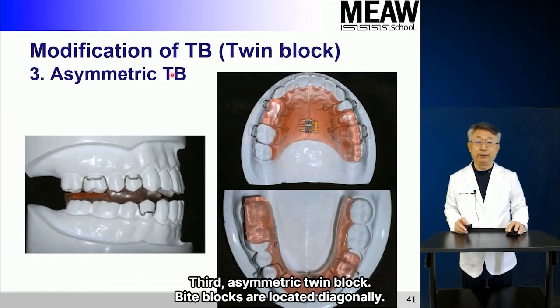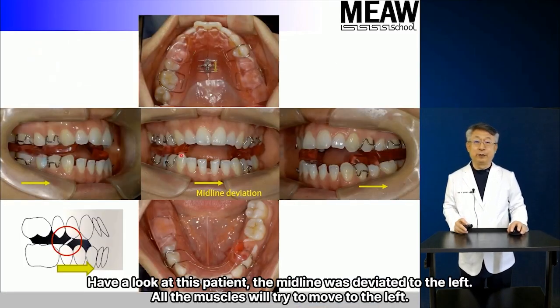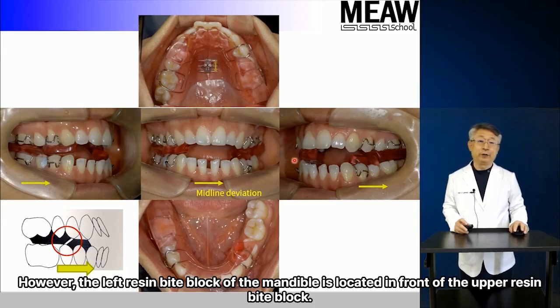Third, asymmetric twin block. Bite blocks are located diagonally. It can also include expansion screws. Have a look at this patient. The midline was deviated to the left. All the muscles will try to move to the left. However, the left resin bite block of the mandible is located in front of the upper resin bite block.